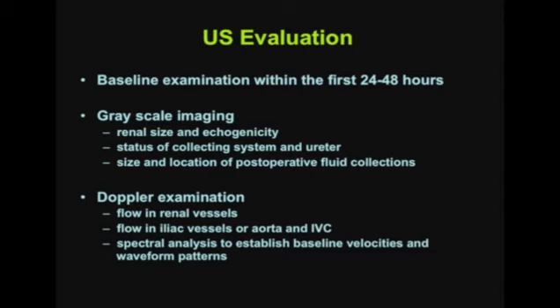We perform a baseline ultrasound examination within the first 24 to 48 hours after transplantation, and we perform a full grayscale imaging examination where we assess renal size and echogenicity, the status of the collecting system and ureter, and we determine the size and location of postoperative fluid collections. As far as the Doppler examination is concerned, we look for flow in the renal vessels as well as in the iliac vessels, aorta or IVC, and we perform spectral analysis to establish baseline velocities and waveform patterns.